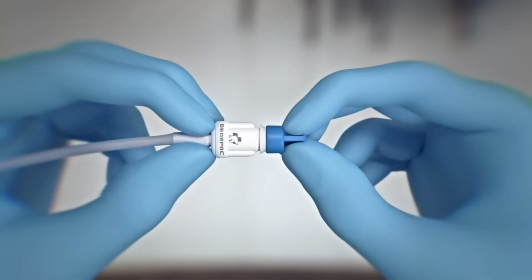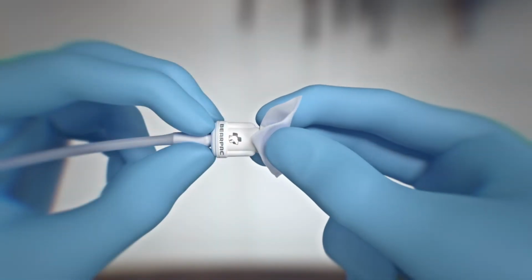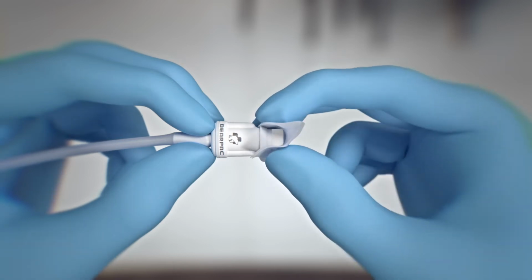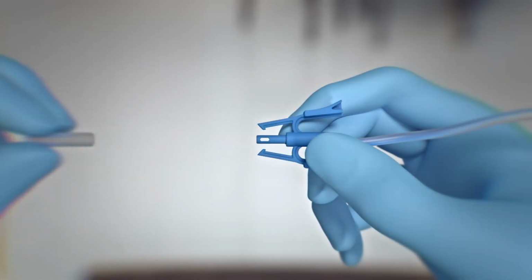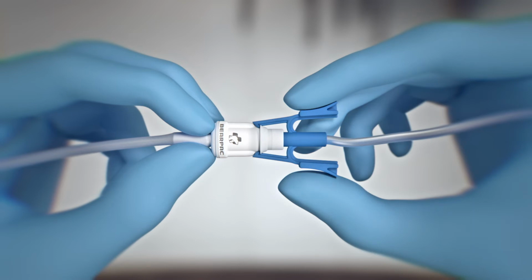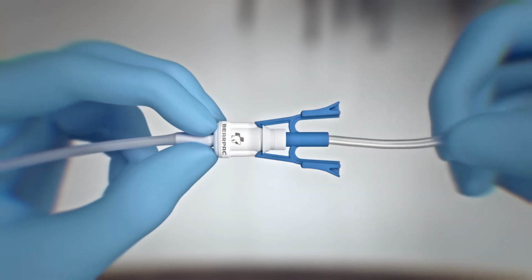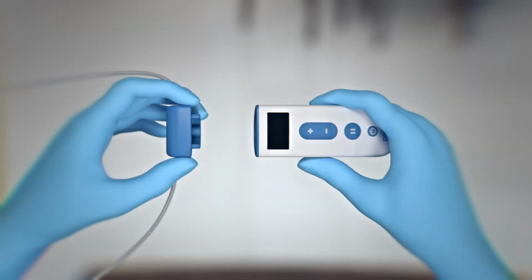Remove the catheter valve cap by pulling it away from the catheter valve and dispose of the cap. Wipe the catheter valve with one of the alcohol pads. First, remove the plastic sheath from the catheter connector. While holding the catheter firmly, insert the catheter connector on the end of the drainage line into the catheter valve until you hear or feel a connection. Gently pull back on the drainage line to confirm the connection is secure.